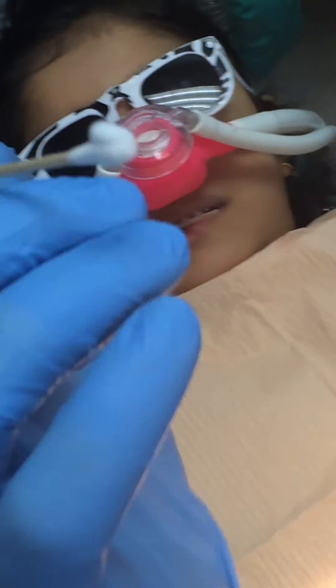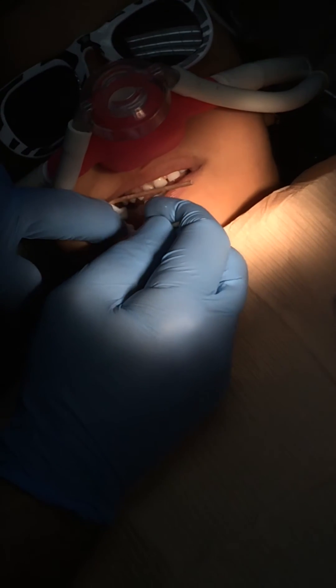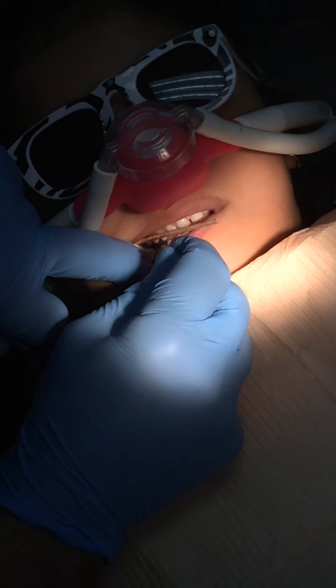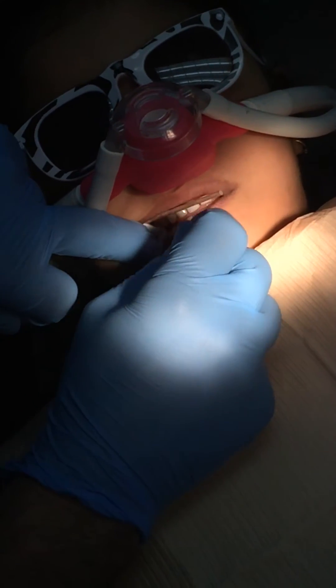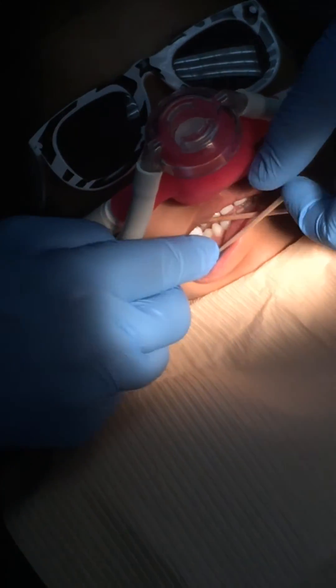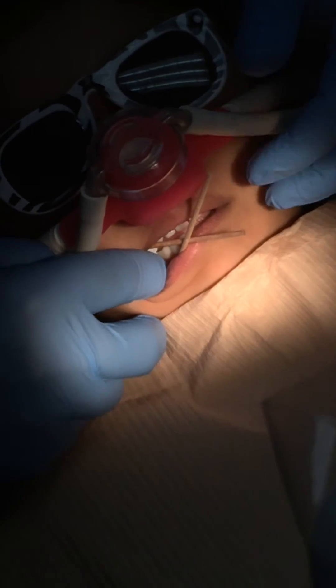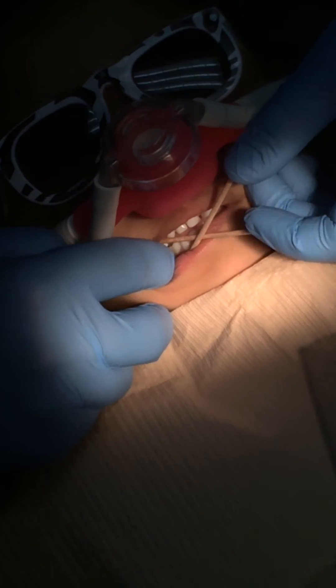Let's get the light in there. Put it right into the vestibule where we're going to place the local, which is essentially just periapical to the molars. In this case, we're putting it right in between the lower D and E — teeth S and T — and that's where we're going to give the local anesthesia.